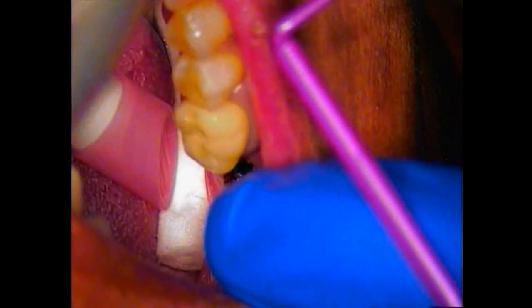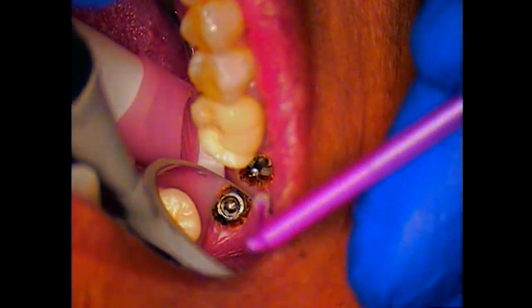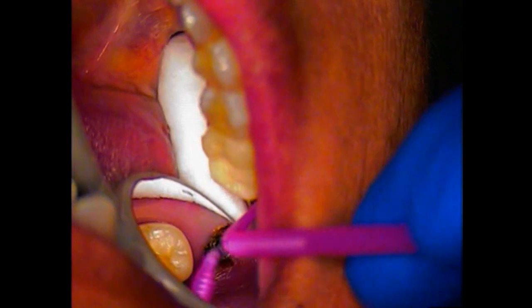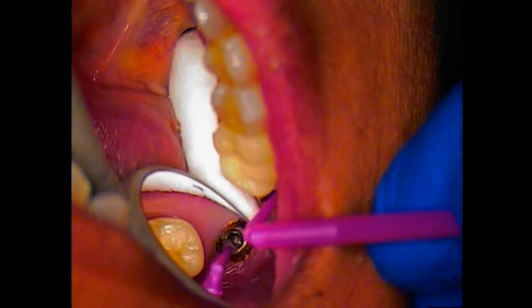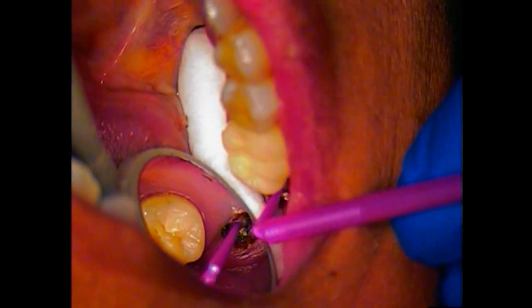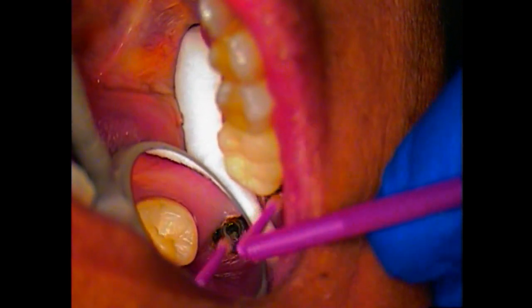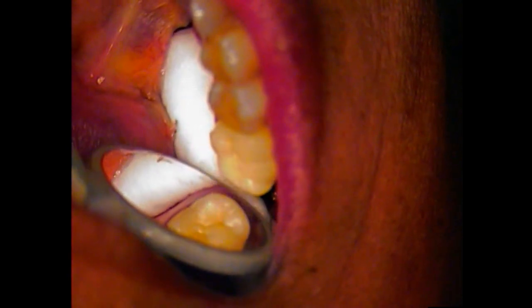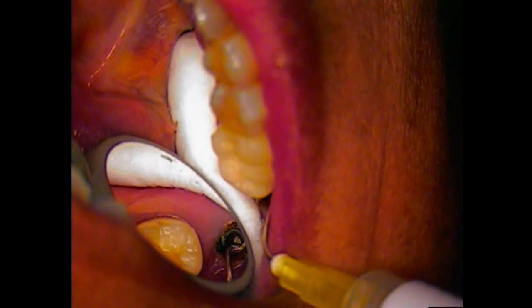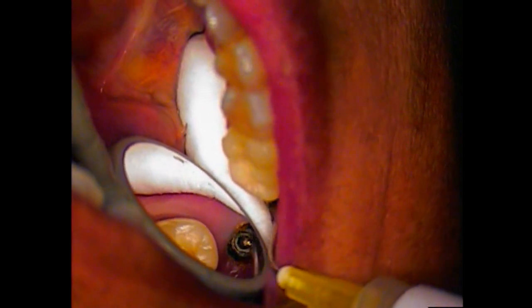We're looking not only for a change in color, but also if there are any little bubbles or anything percolating up through that area. We can go in with a micro suction tip and actually pull out a lot of that — whatever you want to call it, we call it bio-burden. It's a combination of things — food, debris, etc. Here comes the micro suction, going in along the side. Let's see if we can pull anything up. Nothing wants to come up.